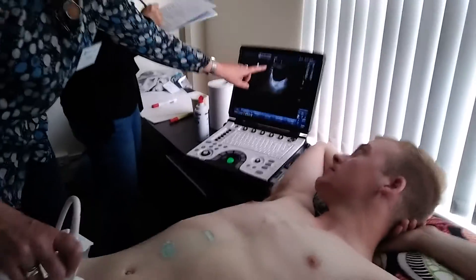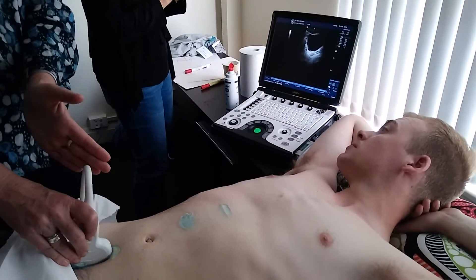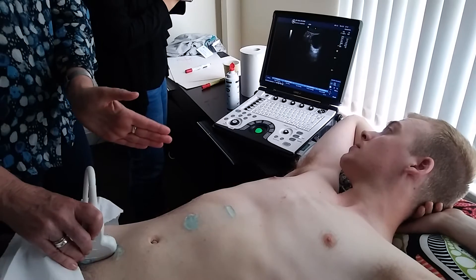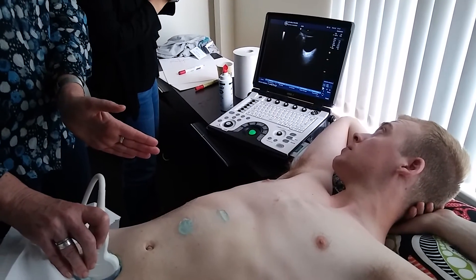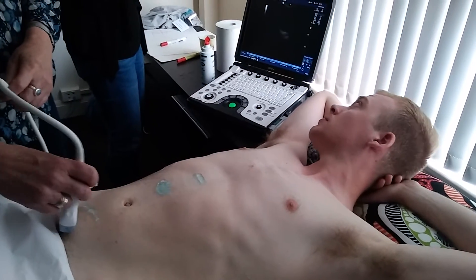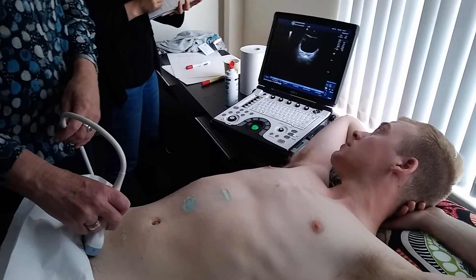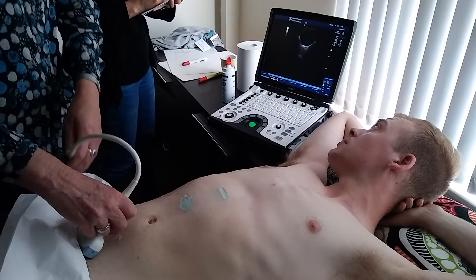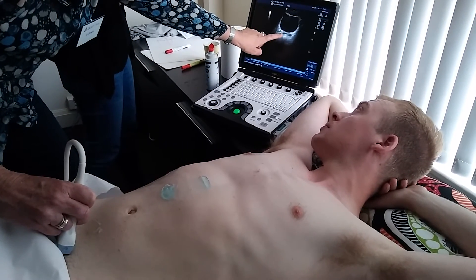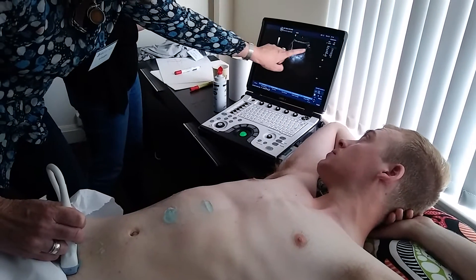The reason I've gone longitudinal is because the fluid could be coming down through the paracolic gutters. It might be that I catch the fluid here before it's got to the retrovesical space because it's longer. From there, all I'm going to do is slide to Jake's right. As soon as you see iliac vessels, you know you've gone far enough. If I come back to the middle, I've got his prostate. If I go to the left, I've got bowel gas and more iliac vessels out here. And there's my fluid. Now, you can do this transverse - you're looking for fluid behind the bladder. It would outline the seminal vesicles - it would be there. There's his iliac sitting there, so it can't be past those.